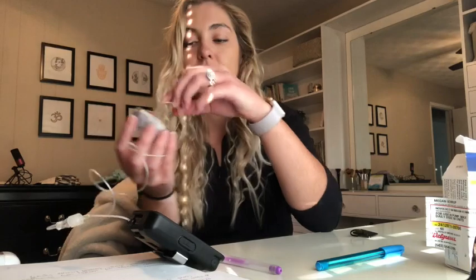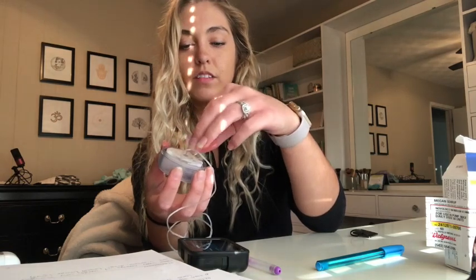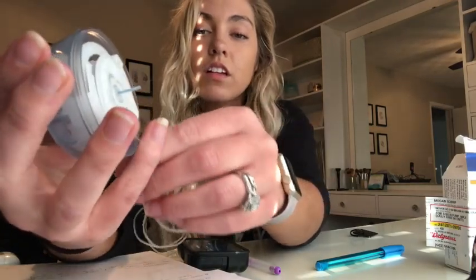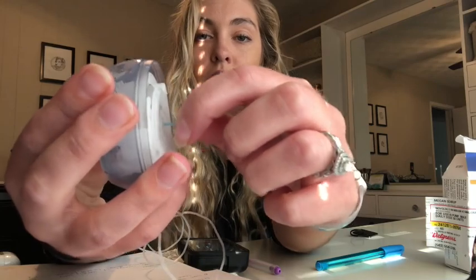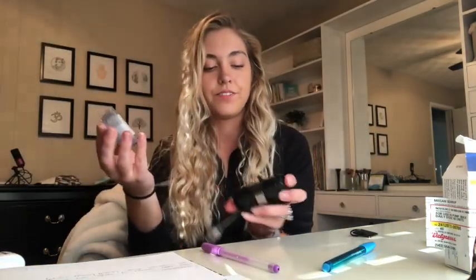Okay, so while the pump is filling, I'm going to pull off this white protective thing of the stickiness. There's definitely a word for that, but I don't know what it is. So I just take that off, and then pull off the little blue protective thing. So that's the needle. And as I wait for it to fill, okay, that's not really gonna focus, but you can kind of see it. Okay, anyway, waiting for it to fill.